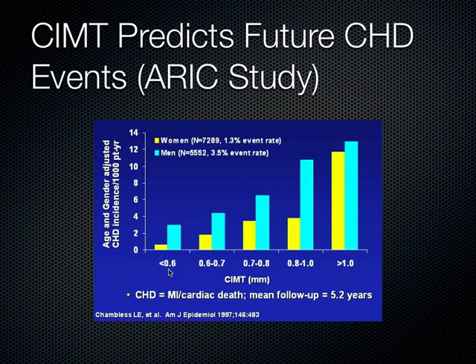So it's not surprising, when you start to think about it, as that carotid intimal medial thickness gets larger and larger, the odds of having a heart attack or dying from cardiac death go up as we go here. And so I think this is one way to help show your patients right there at the bedside that they really should be taking their antihypertensives and also their anti-cholesterol drugs, because showing them their intimal medial thickness and a graph like this will help them be more compliant, I think, with those types of medications.